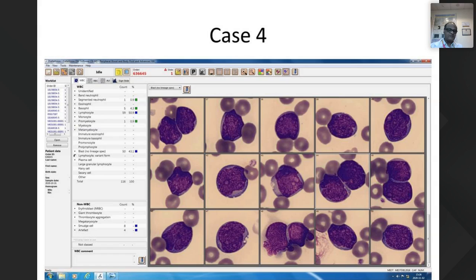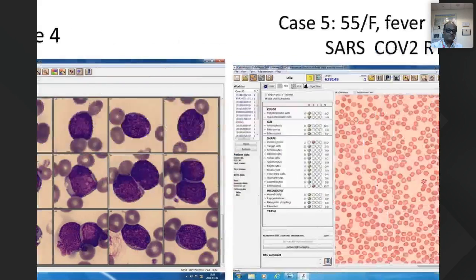So wonderful is the digital morphometry that within a span of about 3 minutes, you are able to get the blast cell count and the confirmation. If you want to have a reference image, you can do a reference image and you can get it.